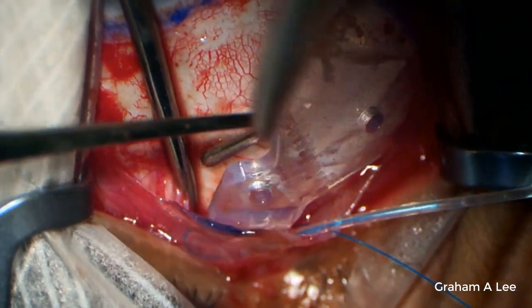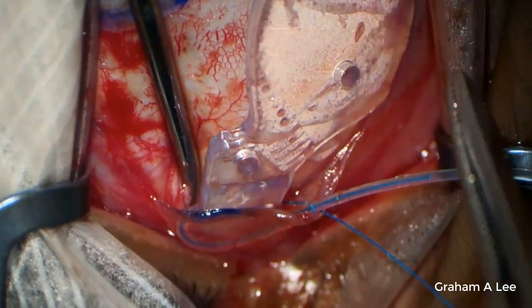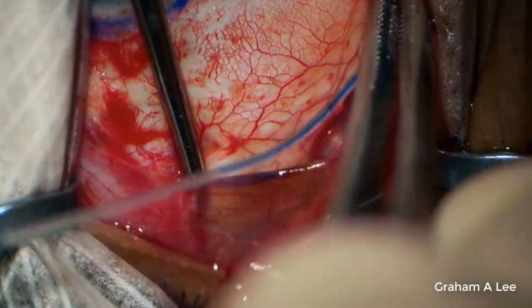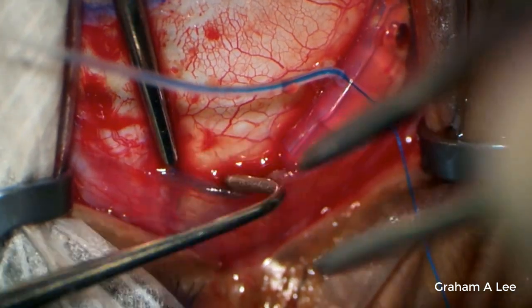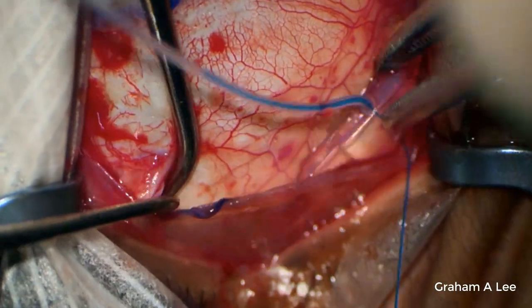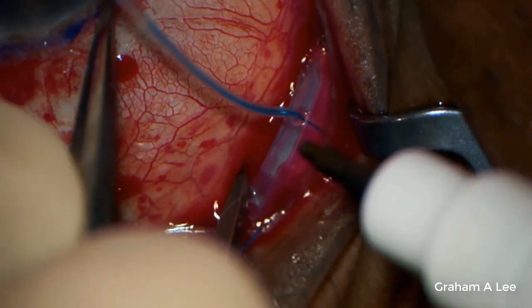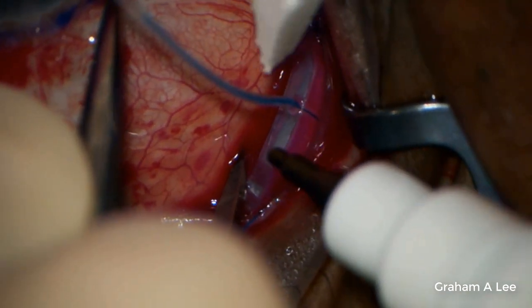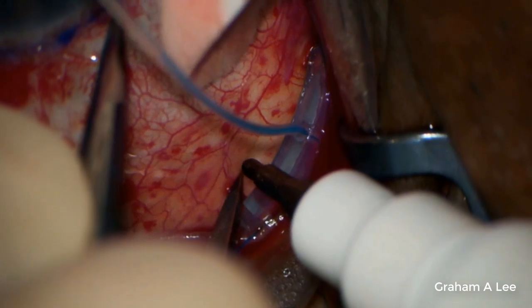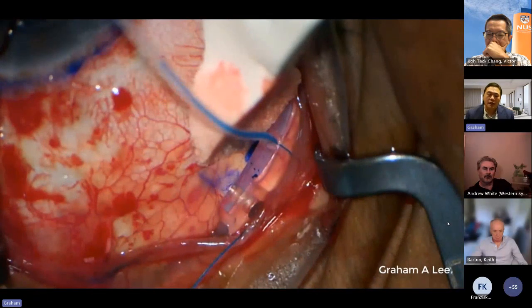So this is just placing the Paul tube. The plate is more flexible than a Baerveldt, but it's not quite as long. So sometimes I find that the wings don't always sit under the muscles well, but apparently it doesn't matter if they sit above the muscle, although I do prefer it to be behind the muscle. I usually like this plate to be at least 10 millimeters back, and I think this is important because the ones that I have had problems with erosion are ones that have migrated forward. So I do like the suture placement for the holes to be 10 millimeters back.